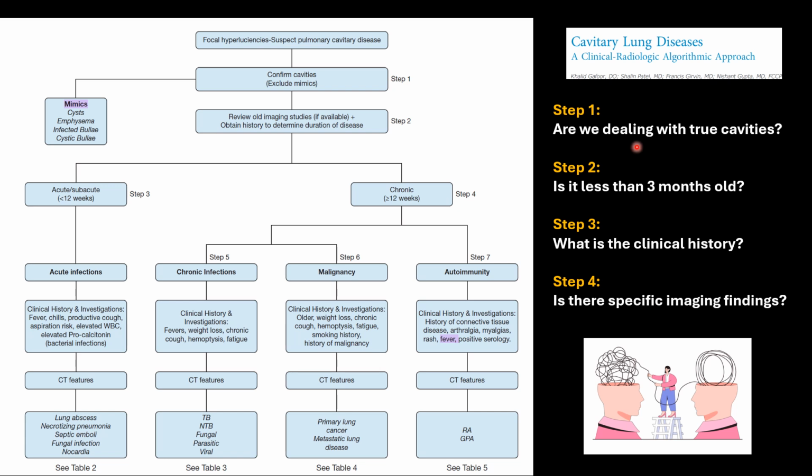So this is a very good approach which has been given by Gafoor. We saw all these reasons of cavity in day-to-day clinical practice. When you are meeting a cavity, how to proceed, that is what has been told by Gafoor.